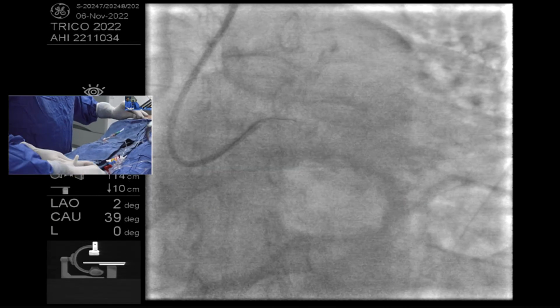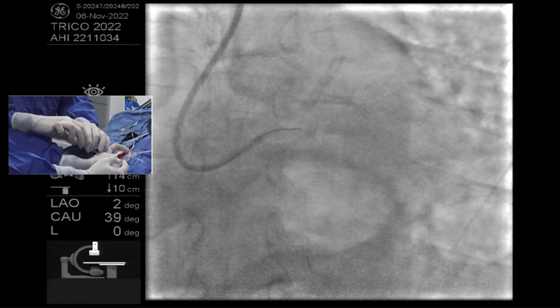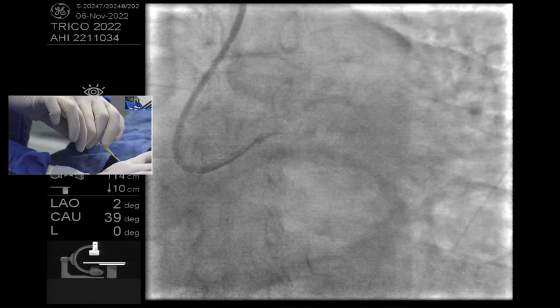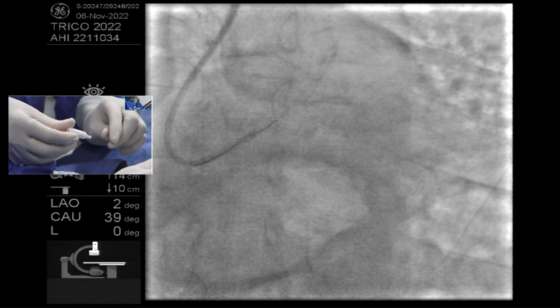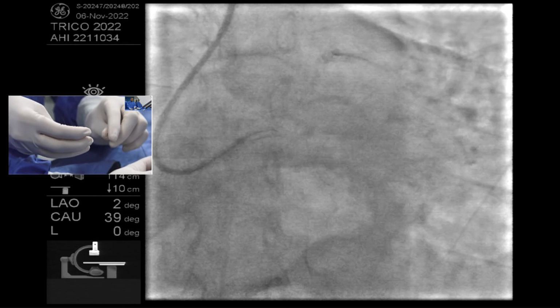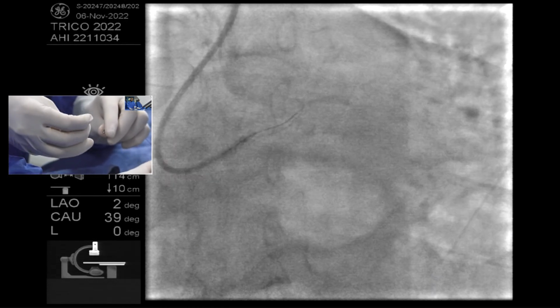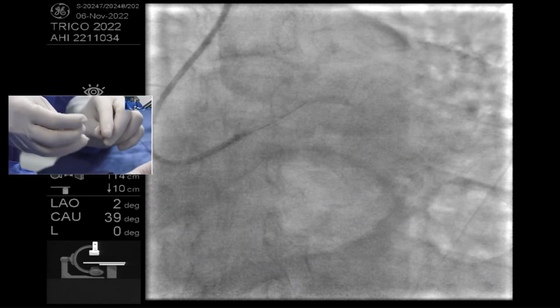I am just simply trying to push. Oh, no. There is an angle there, and it has a tendency to go in diagonal. Sanjay, I think we need to give a little.